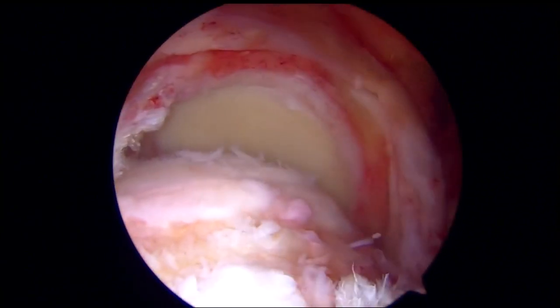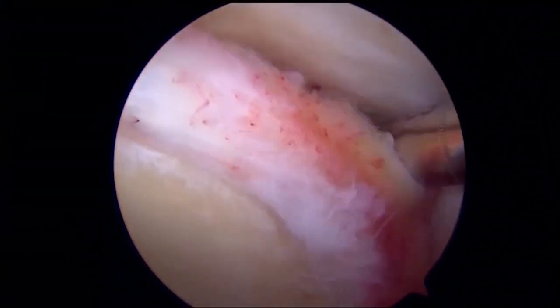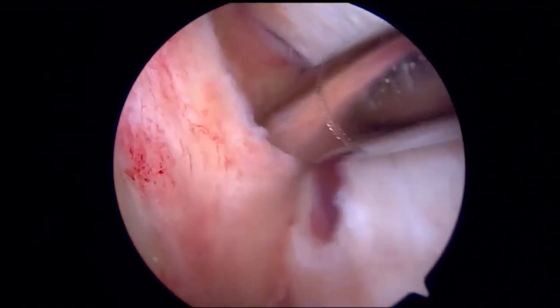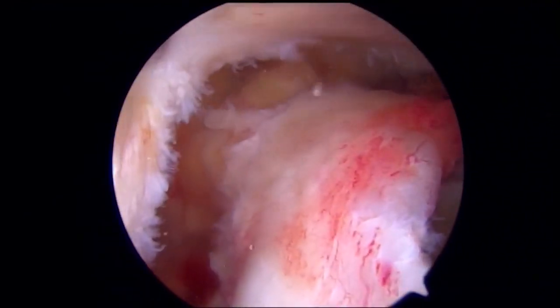In this example, a capsule release is shown, and its ability to lateralize the rotator cuff to some extent is demonstrated. One can see the glenoid to the left, the posterior capsule to the right, and we can see a 270-degree capsule release.